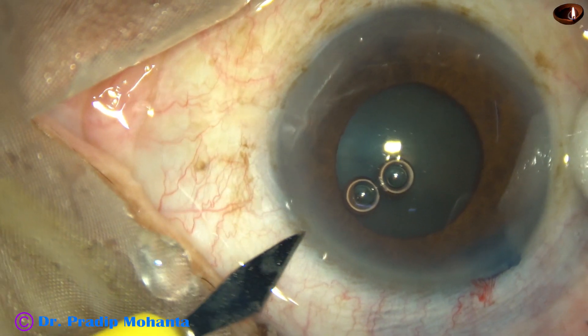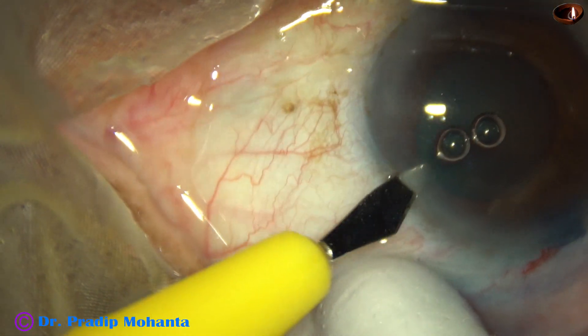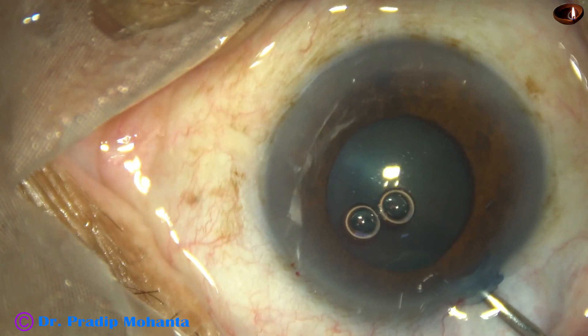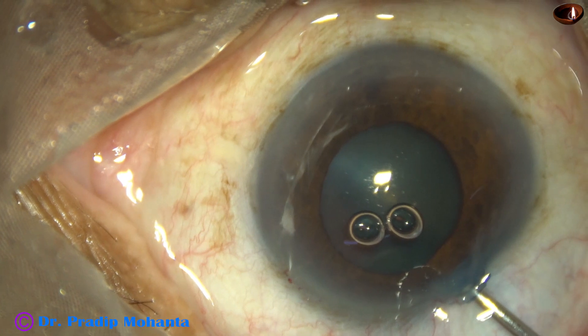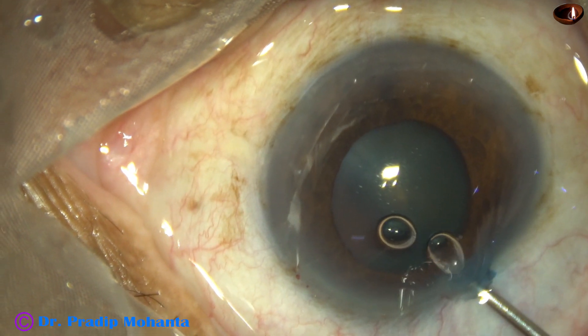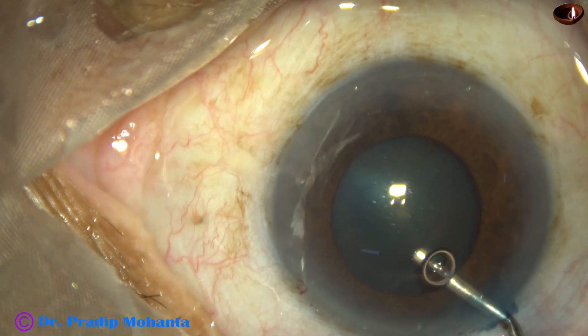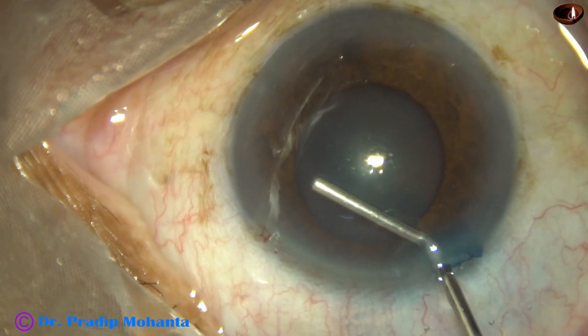This is a side port on the left side of the main incision, about 2.5 clock hours away. And now these two air bubbles are removed to get better visualization of the anterior capsule.